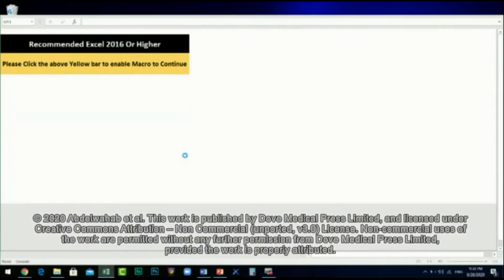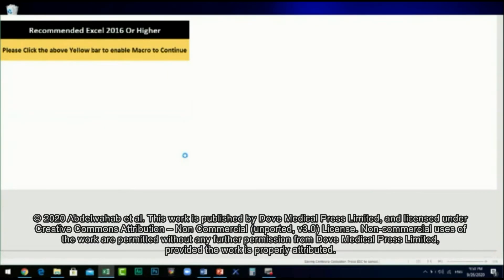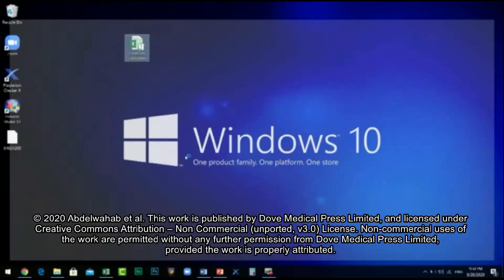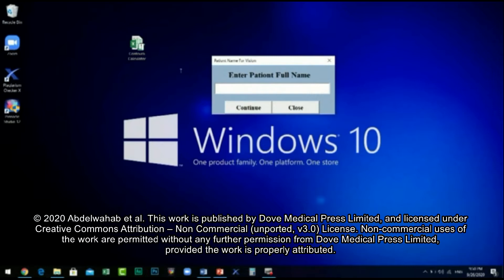After downloading the Counter Calculator, enable the macro to continue to the Counter Calculator interface. Then enter the patient's first and last name.